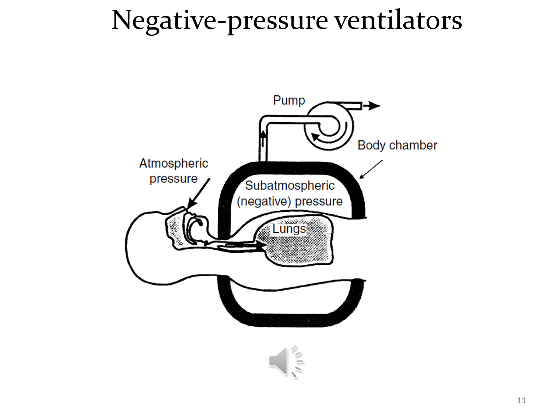Negative pressure ventilators. The flow of air to the lungs is created by generating a negative pressure around the patient's thoracic cage. The negative pressure moves the thoracic wall outward, expanding the intrathoracic volume and dropping the pressure inside the lungs. The pressure gradient between the atmosphere and the lungs causes the flow of atmospheric air into the lungs.